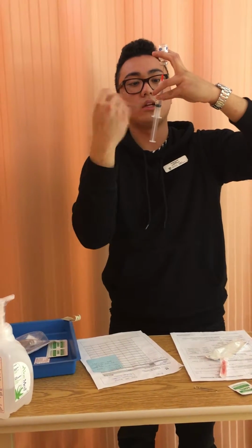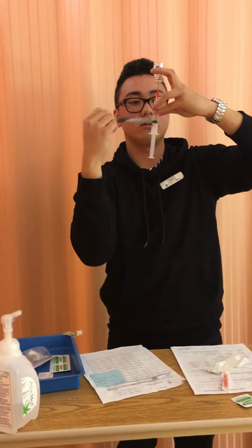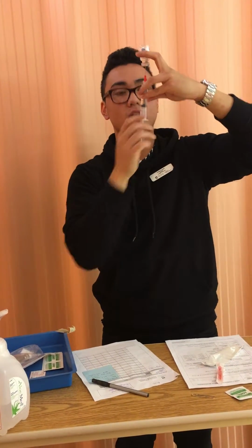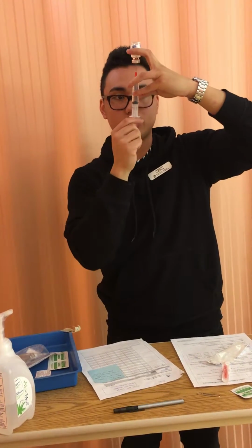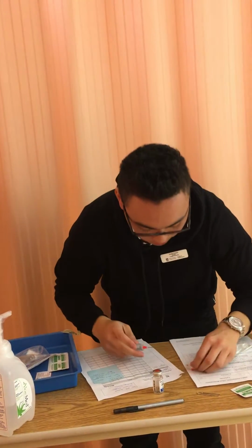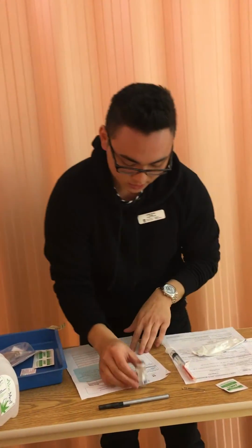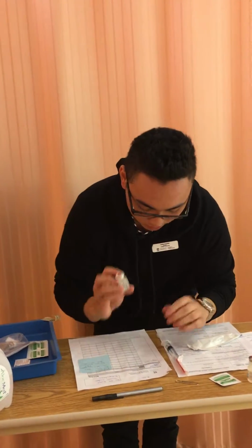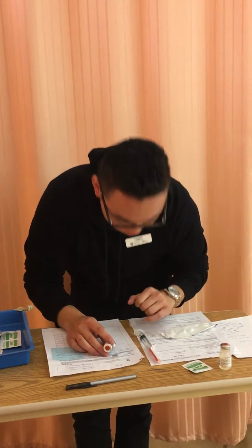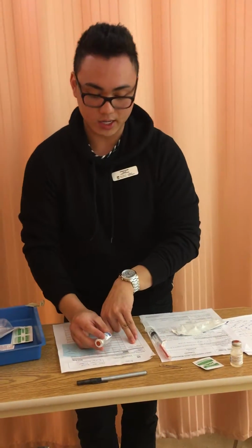Get rid of any air bubbles, because that will affect the amount of medication we are giving our patient. Okay, we have 7.9 milliliters. Okay. And now we will do our second med check. So, right patient is Penelope Pacheco. Our right drug, Cefazolin, is right here that we drew. 750 milligrams equals 7.9 milliliters, which we have here, given through IV every 8 hours, and it is due right now.